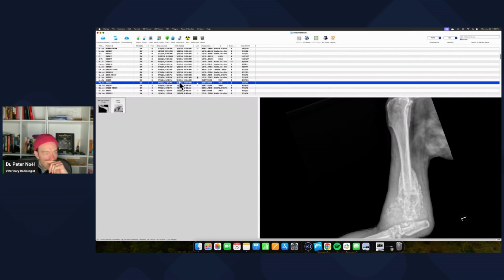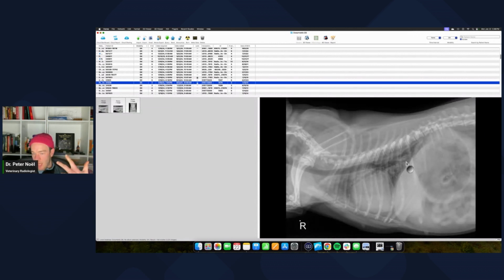Okay, so the lung pattern in this case is most likely the result of sildenafil responsive pulmonary infiltrate. So they get an edema secondary to these high pressure pulmonary hypertension. In my experience, they tend to be more chronic, not like a PTE pulmonary hypertension. I think this dog has right-sided cardiomegaly secondary to pulmonary hypertension, and I think it's chronic, and it's resulted in this sort of incredibly paradoxical caudodorsal sildenafil responsive pulmonary infiltrate.